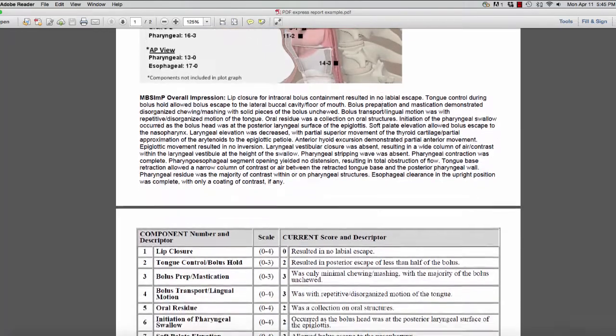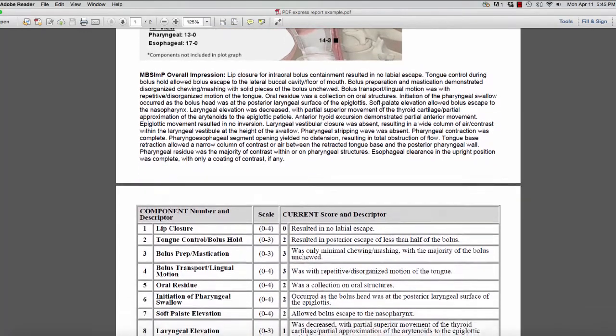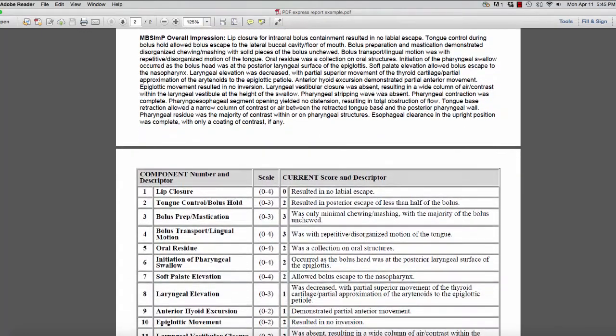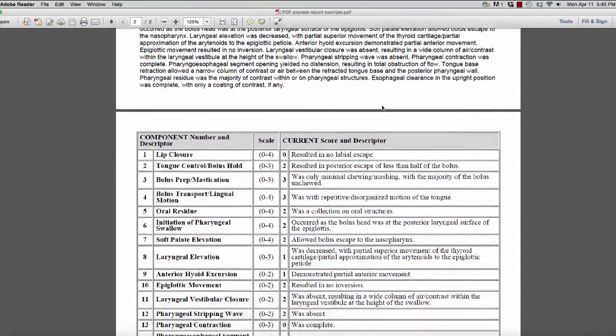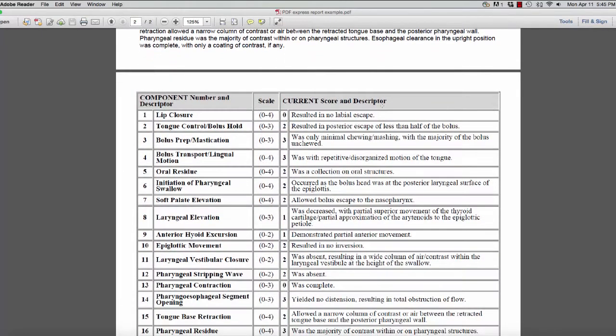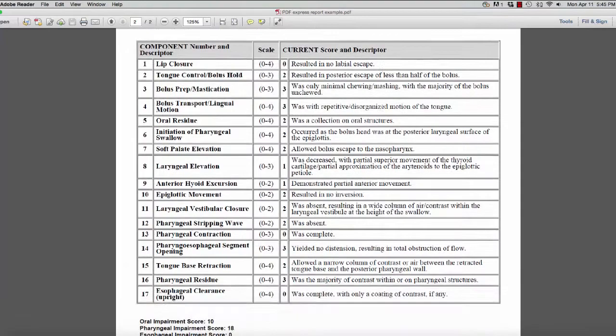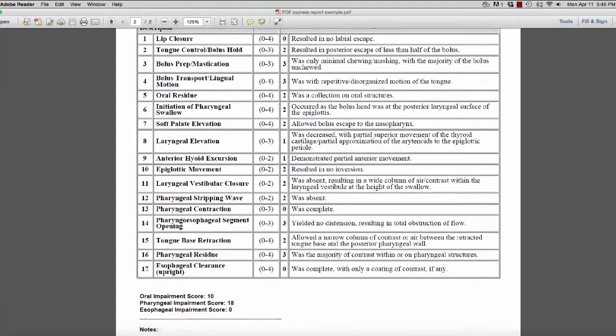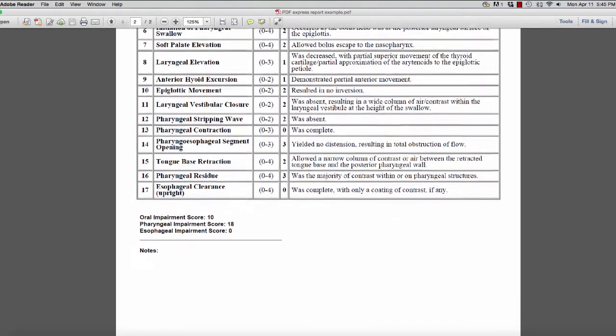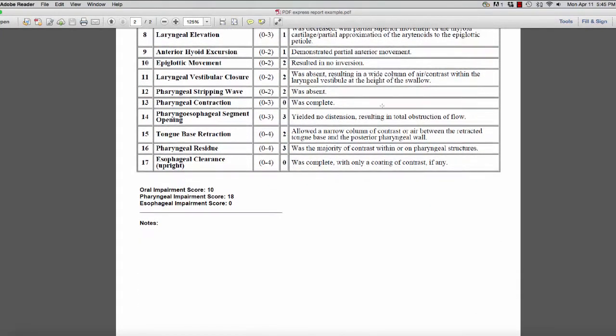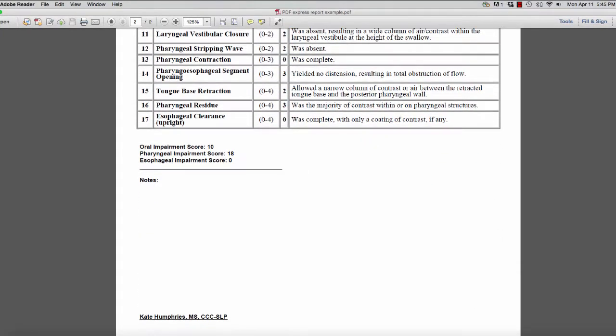This image is derived directly from the information entered into the report and complements the descriptive table containing the MBS IMP overall impression scores and nomenclature.